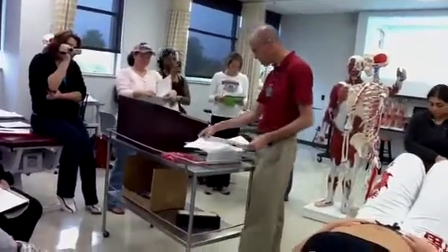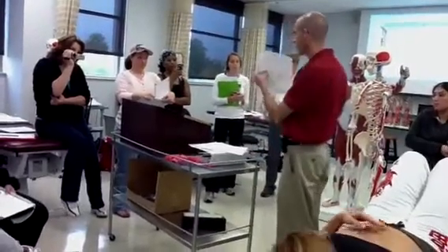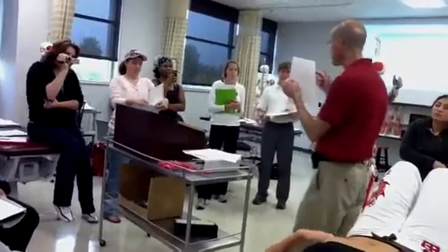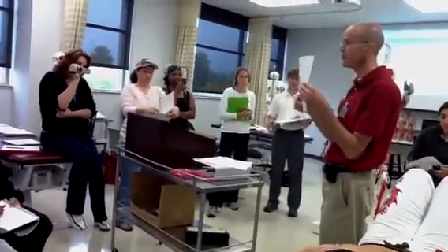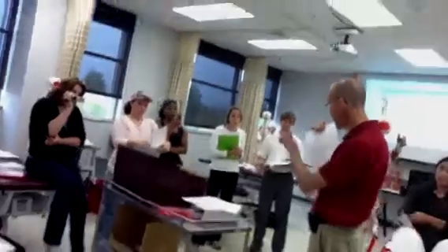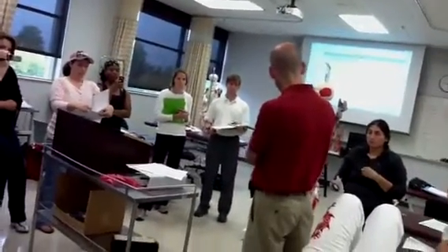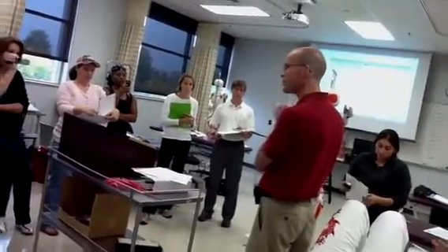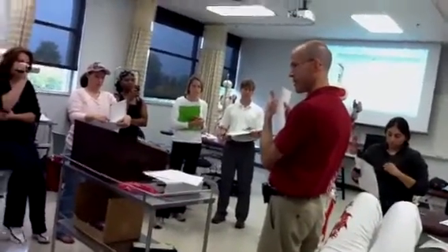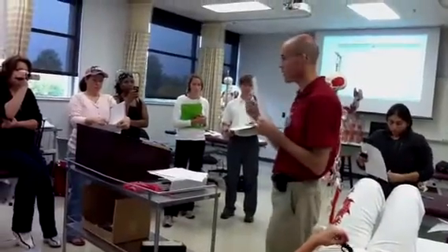The way that's going to work is I'm going to have this piece of paper somewhere close by you. You can see there's room for all the shoulder joint movements. So I'll say, go ahead and record what you got. So you'll walk over and you'll find shoulder flexion, and you'll write out the goniometric measurement right there. How are you going to write that out?